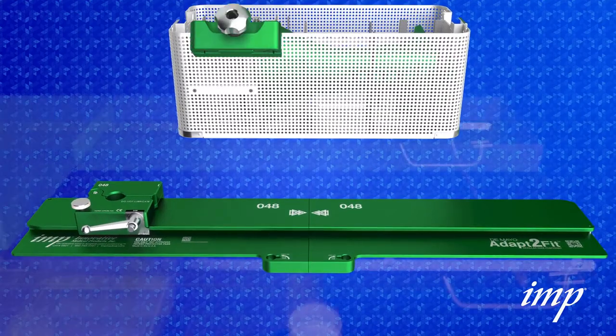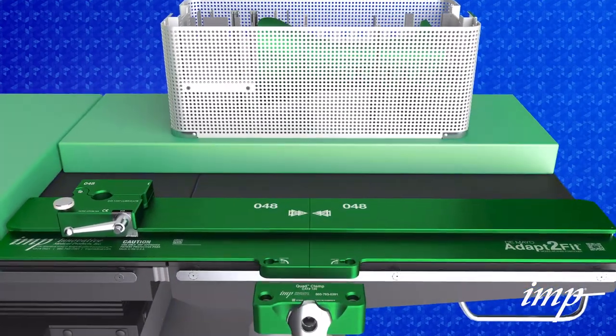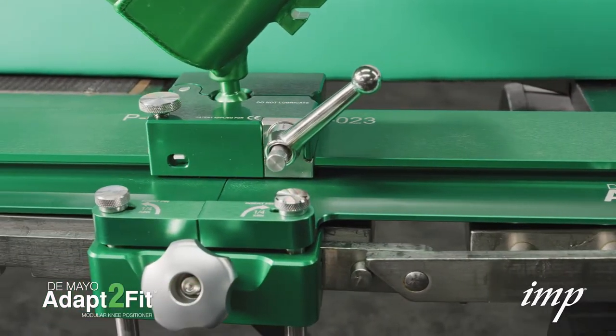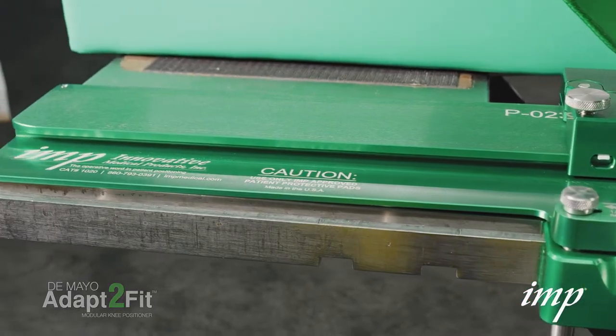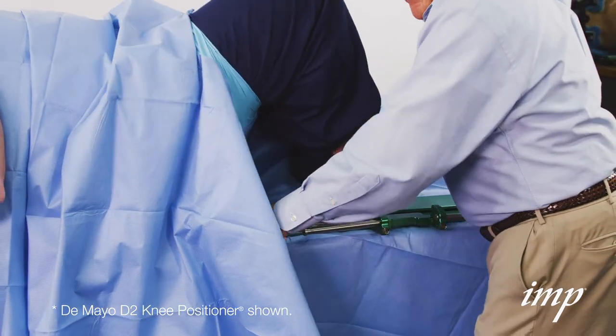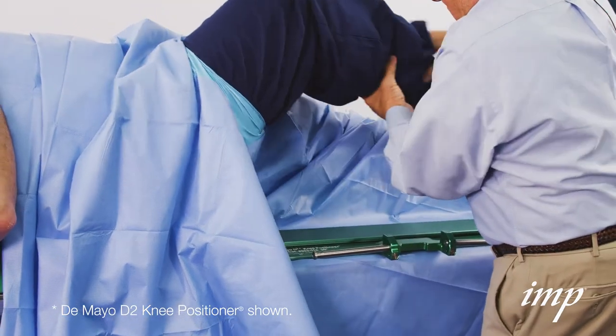Place the DeMaio Adapt-to-Fit Modular Knee Positioner in the well to achieve maximum flexion. The Adapt-to-Fit is designed to fit perfectly into the well created with no overhang. Check flexion for final approval of freedom of the drape to allow full range of motion when the positioner is locked on the drapes.